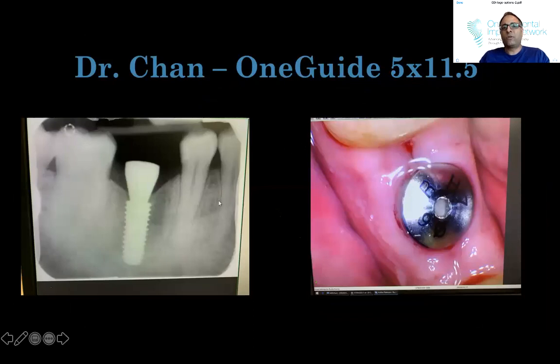So this was Dr. Chan. I don't know if Peter is out there, but he had a question in regards to seating a healing abutment. He had seated one, and sometimes it's a little bit hard to tell, and we're going to talk about that today.